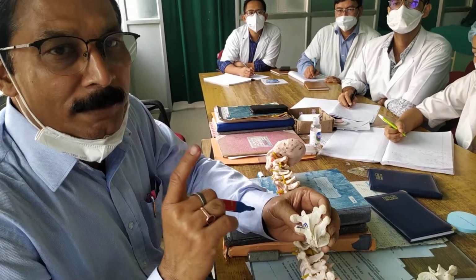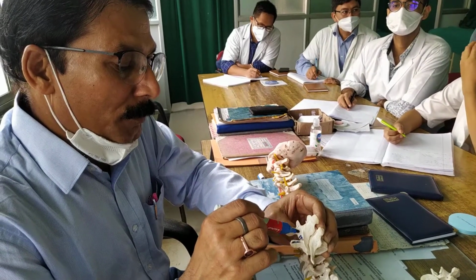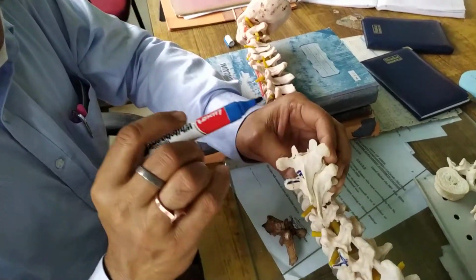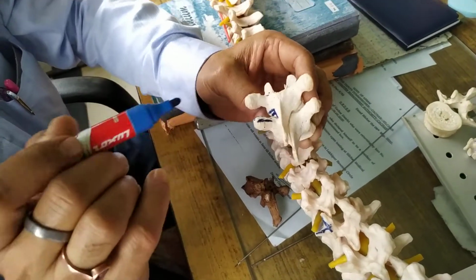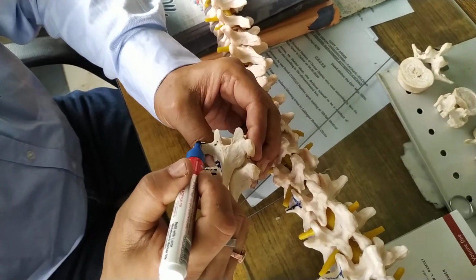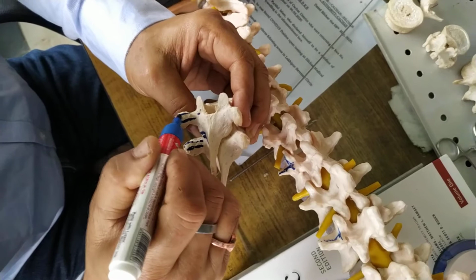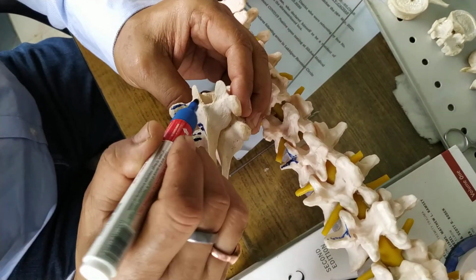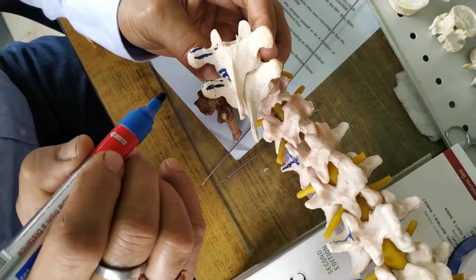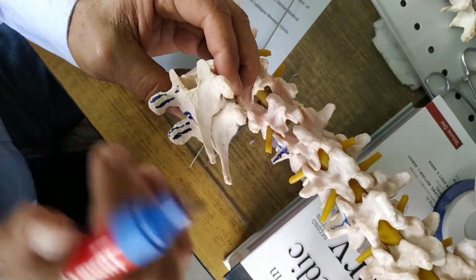Now you trace it down, go like this towards the medial side. Then you find out the midpoint over here. See, already you have dissected this part. So in this case, you are going to divide this into 3 halves like this. I am extending this point over there and finding the midpoint of the superior articular surface. This is the superior articular surface which is denominated.